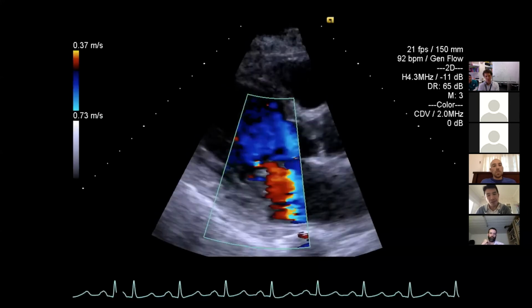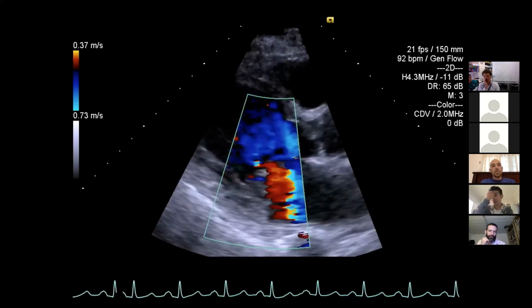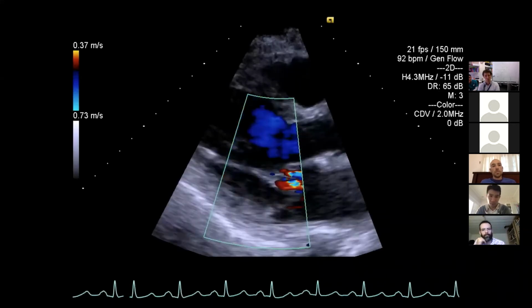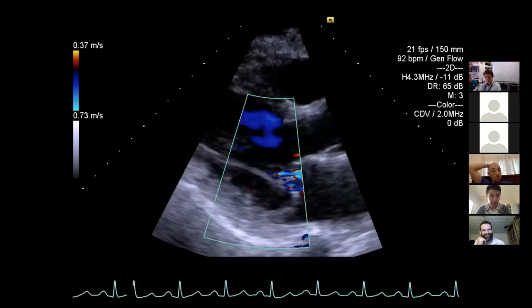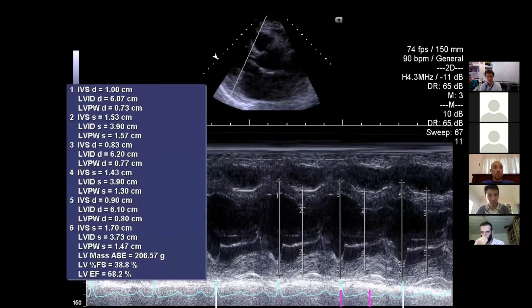Very nice. I can't remember what I was messing around with doing these pictures, but what's going on with the color here? Why is it all weird? Well, you've got this scale set more towards the blue than the red. Yeah. So I completely messed that up. Yep, fantastic.